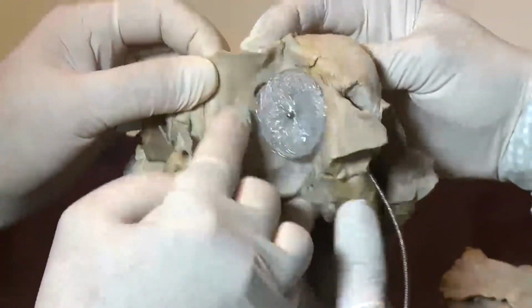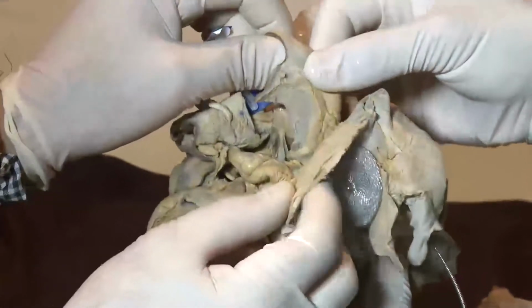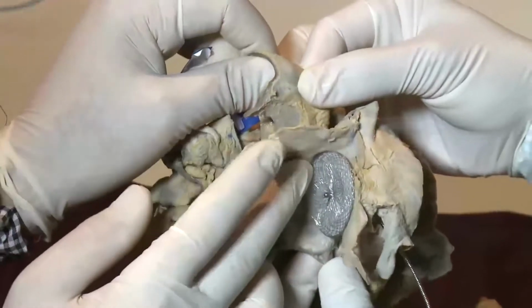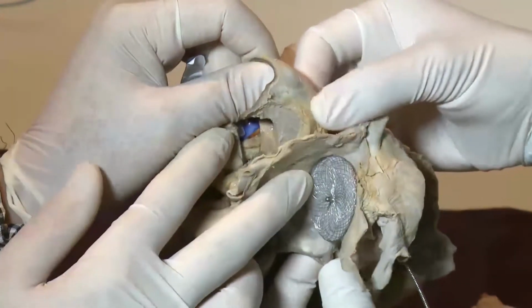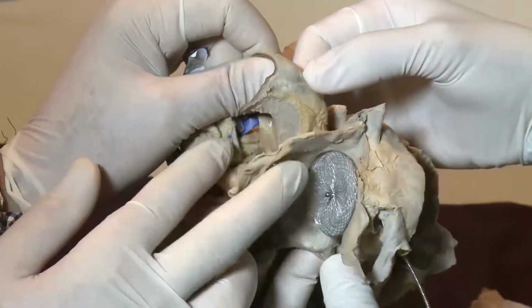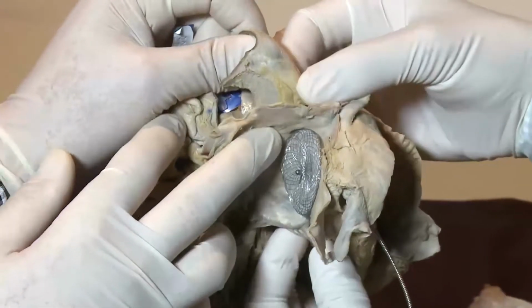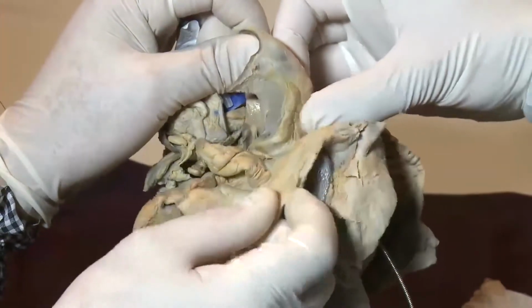When the anterior portion is directly behind the aorta, it may cause erosion, but I have never experienced this kind of complication. Also, the device does not directly touch the aorta posteriorly. There is a transverse sinus.